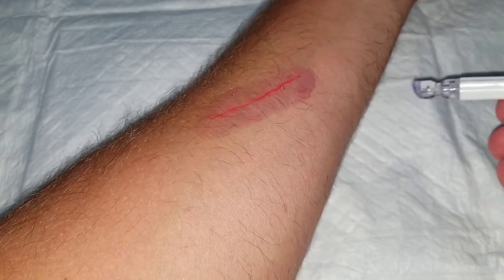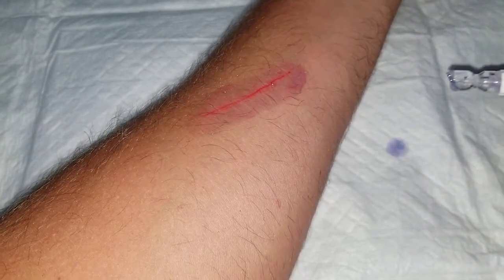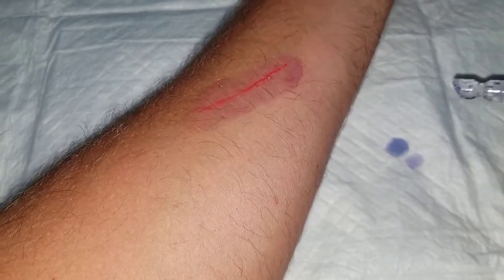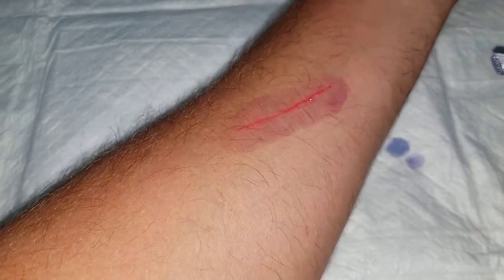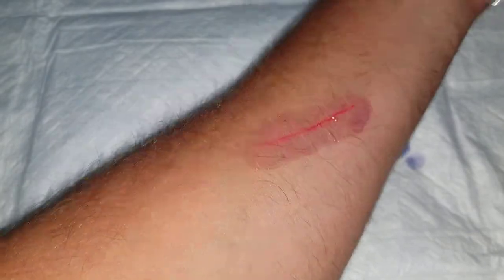If you're doing this over anything else, give it a quick squeeze to get some glue out. That way it keeps this from clogging up on you, and it's going to give that a chance to dry. Kind of looking at that, and it looks like that's dry.